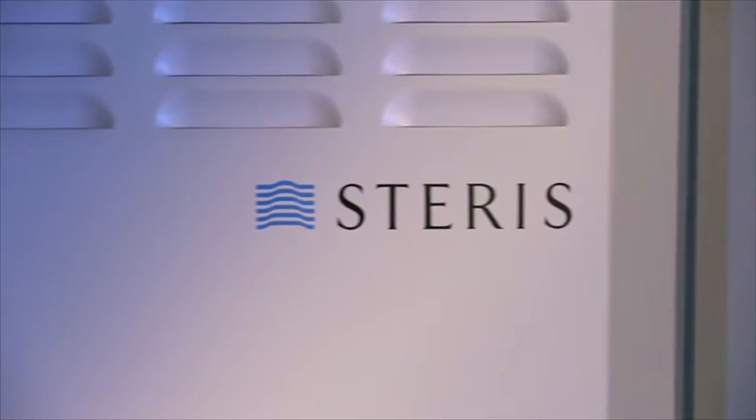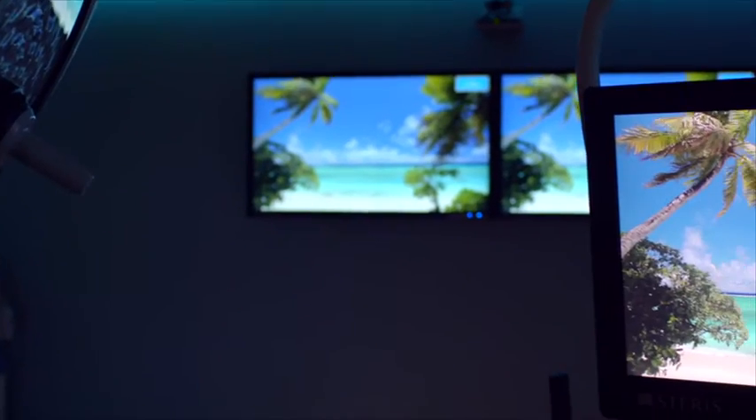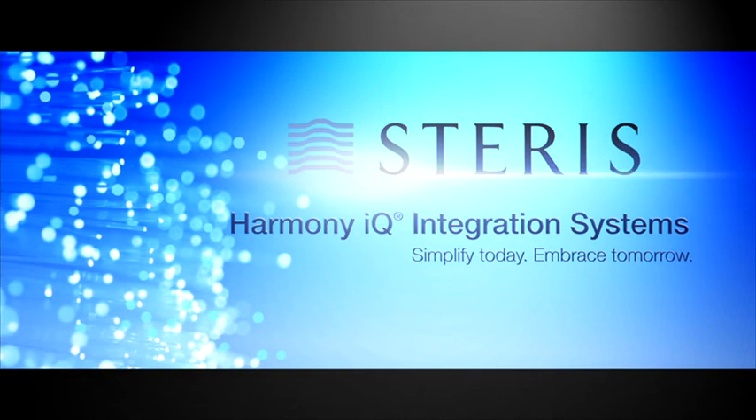We've designed our integration solution to be easy to use, easy to upgrade, and geared toward improving quality patient care. We get a lot of feedback from our customers — excited about it, couldn't imagine life before OR integration. And what we consider high tech today will probably be commonplace in two or three years. Explore OR integration with Steris.